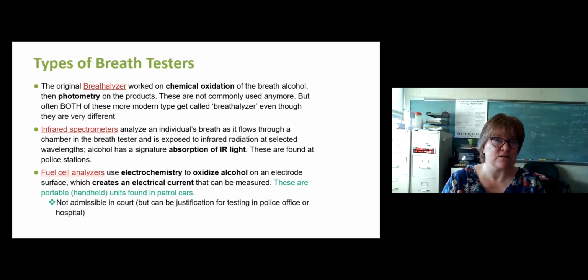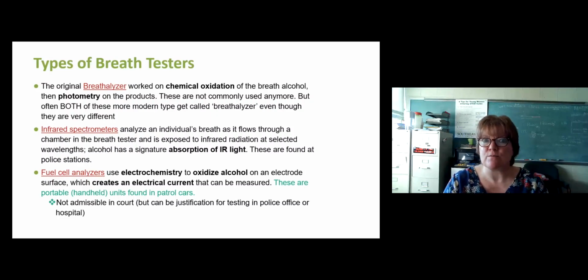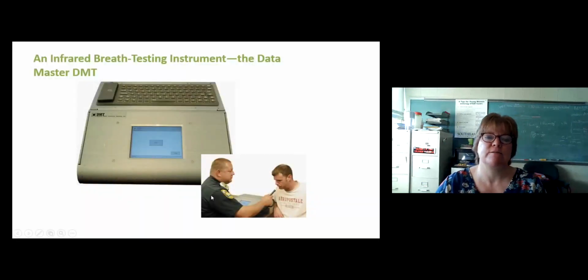It can sometimes be measuring other things, and there are techniques to make them pretty sensitive and pretty accurate, but they're not eligible to be admitted into court as evidence because there are some issues with those breathalyzers. But they work great for being out in the field. They're nice, small, and handheld, but they are not currently allowed in court. They're not quite sensitive enough.